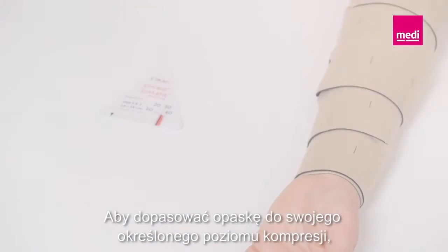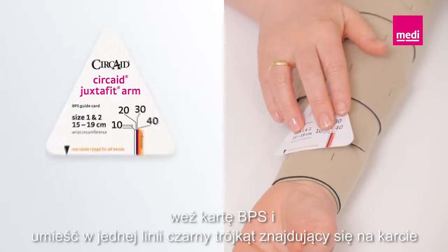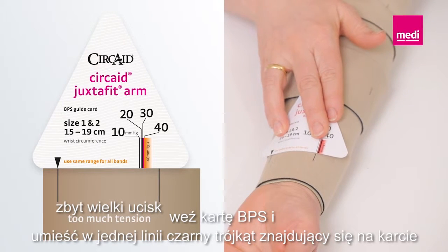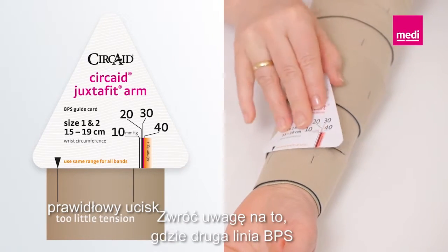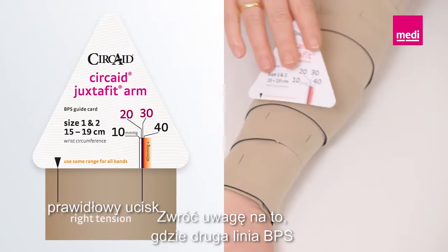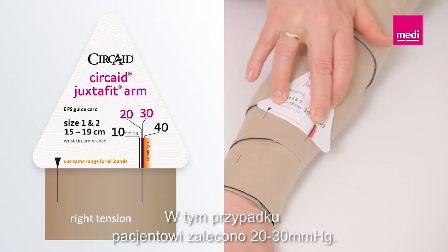To adjust the garment to your indicated compression level, take the BPS card and line up the black triangle on the card with one of the BPS lines on the wristband. Note where the second BPS line lines up with the card's compression ranges. In this case, the patient needs 20 to 30 millimeters of mercury.